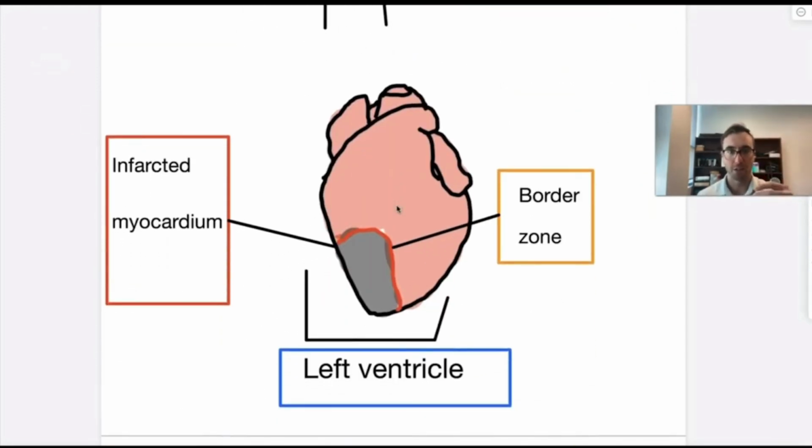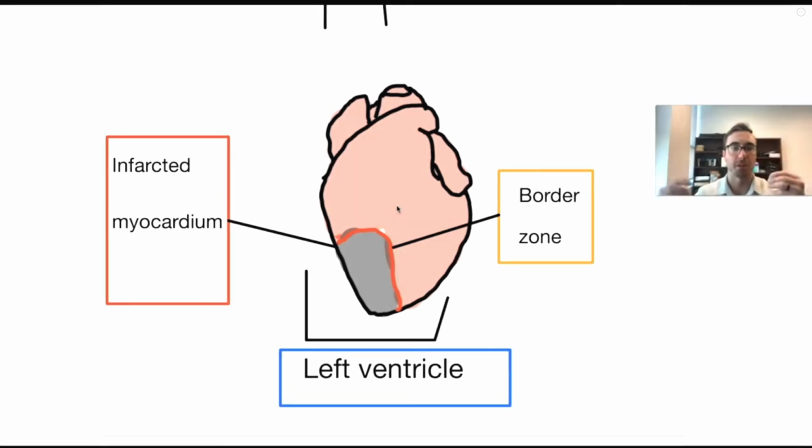If we apply it to the areas, the bottom left portion, which is the inferior and posterior aspect of our heart, is less likely to convert because standard defibrillation doesn't hit that portion enough to paralyze at least 75% of our cells.